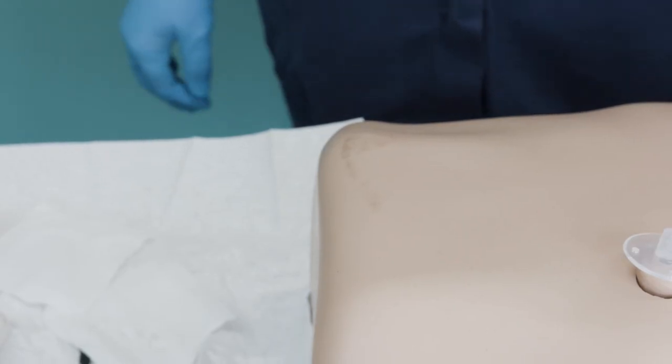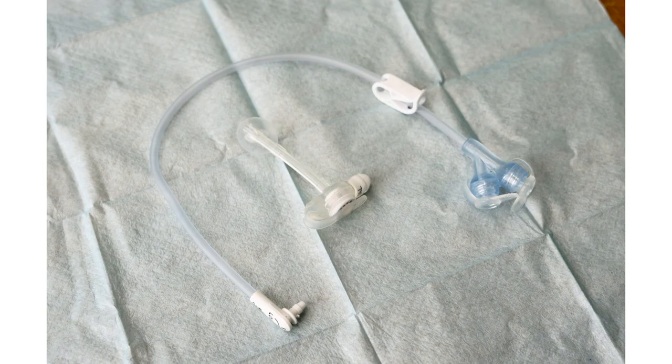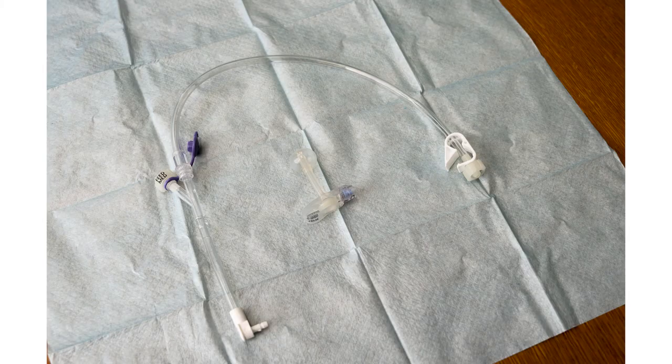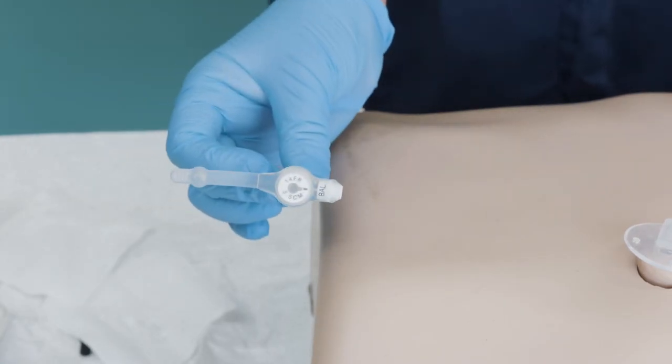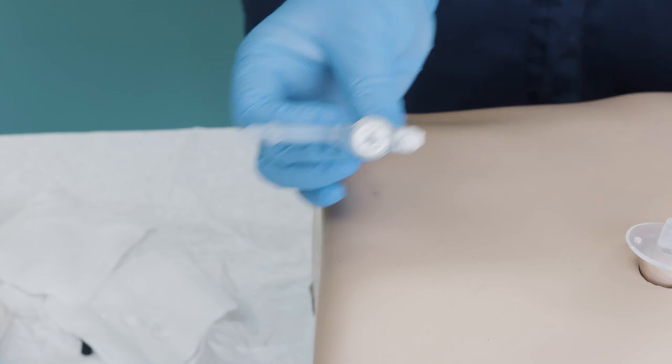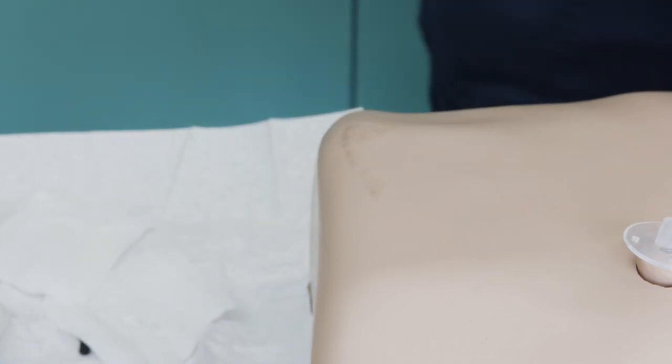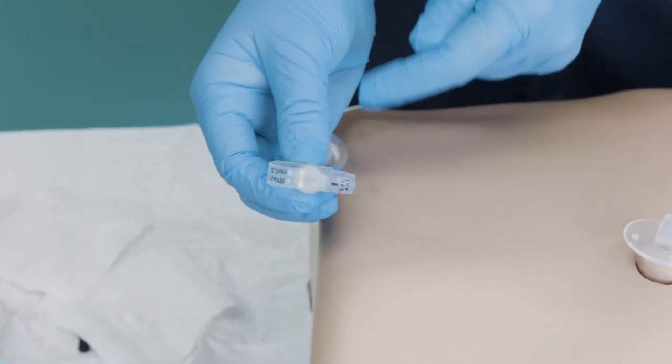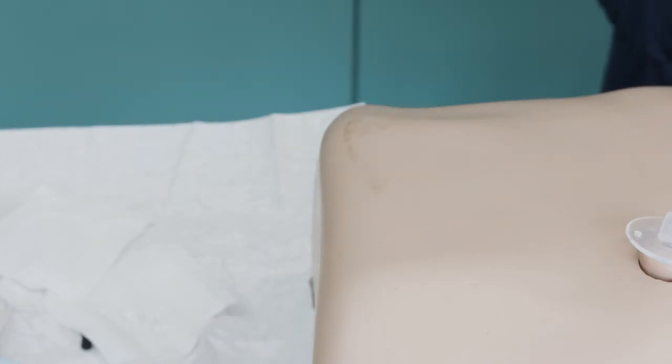If you are replacing a button device, i.e. a mickey or mini button, then the process of replacing the tube is the same. But bear in mind that the balloon valve is on the side of the button, and that you will need an extension set to connect to the button when aspirating the stomach to check the tube position.